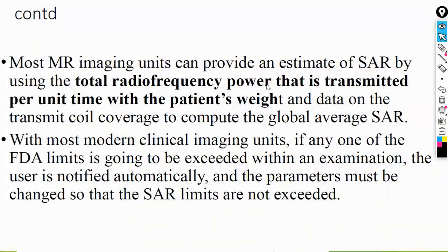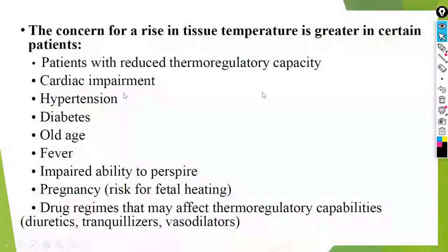The more I increase the 180-degree RF pulse, the more I am increasing the energy that gets absorbed within the skin. This raises the temperature of the tissues inside the patient.